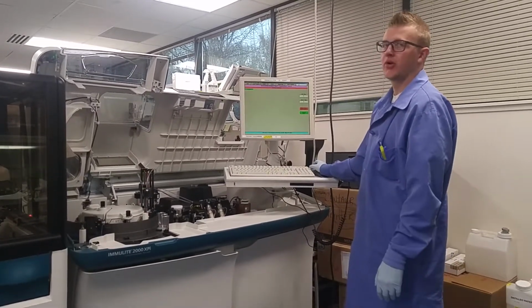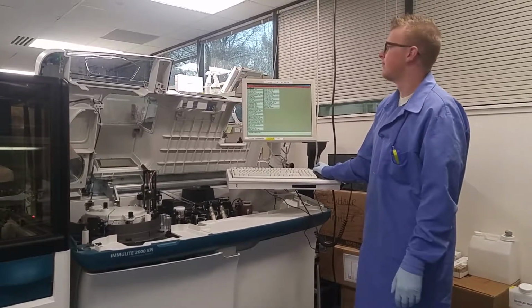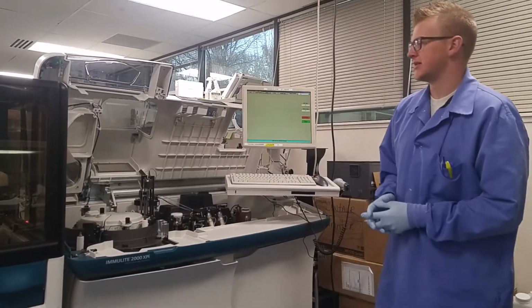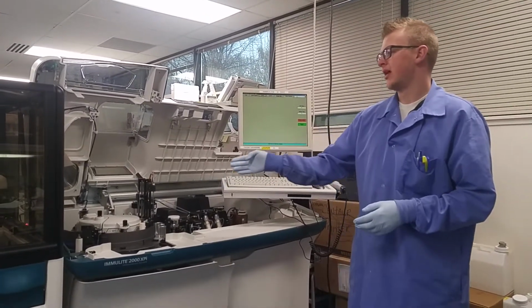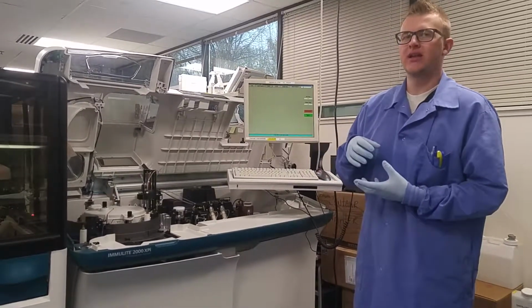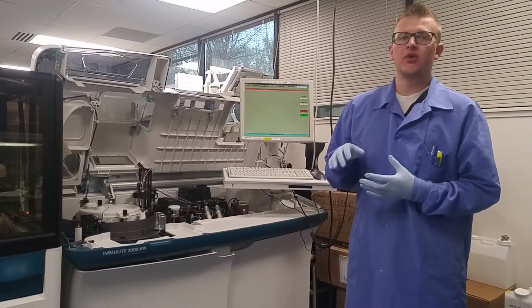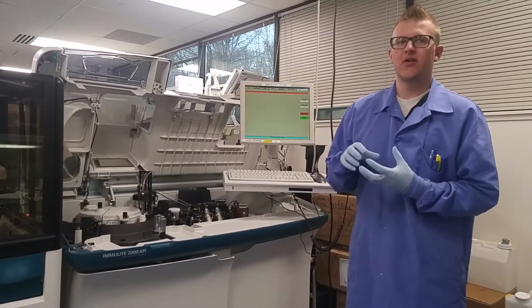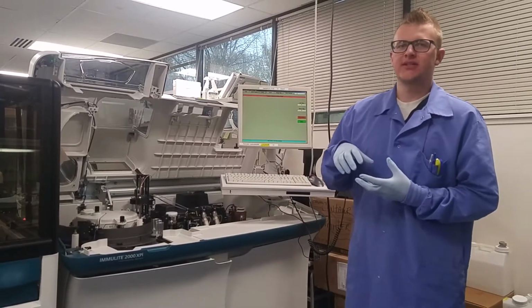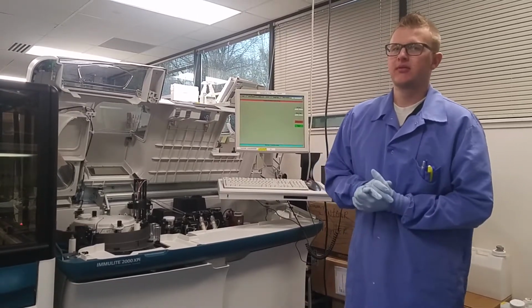So now go back to load program, and we're going to select Clot Prime. We're going to run that program. So what Clot Prime does is it will take this sample probe, and it's going to purge anything from the internal, inside of the probe, the internal workings. It will also purge the transducer cavity of all fluid in case a Clot was in that reservoir. Once it's all purged, it will then signal me to allow me to refill it, and we'll move on to the next step.